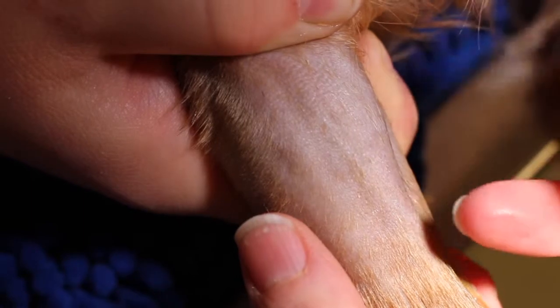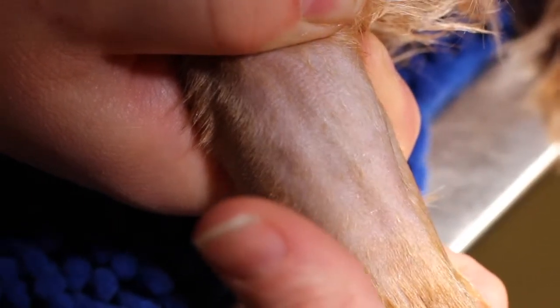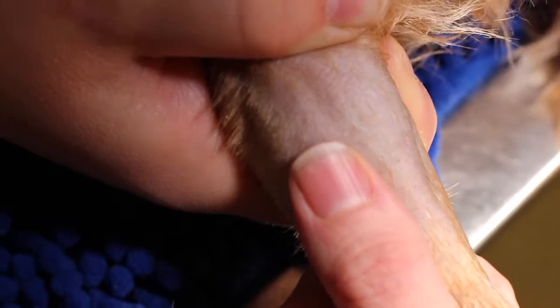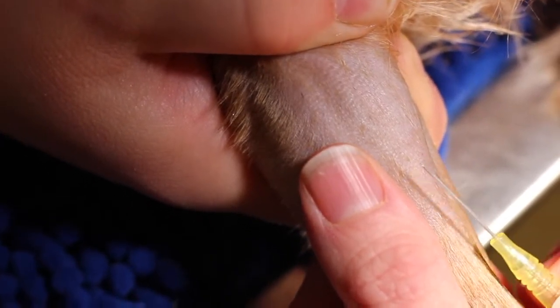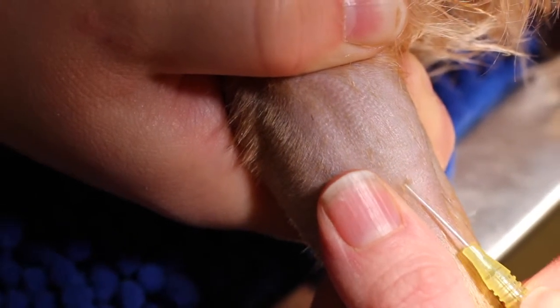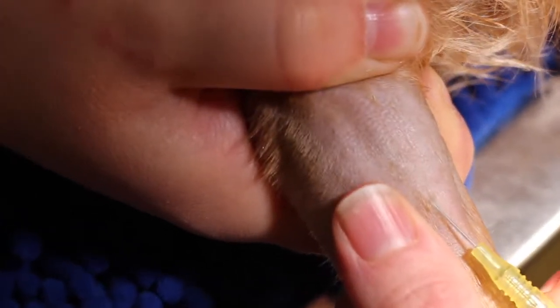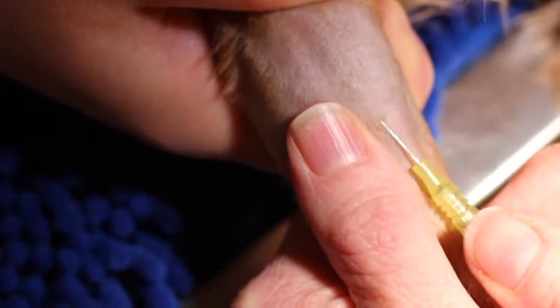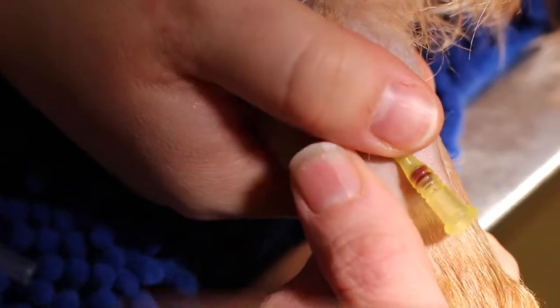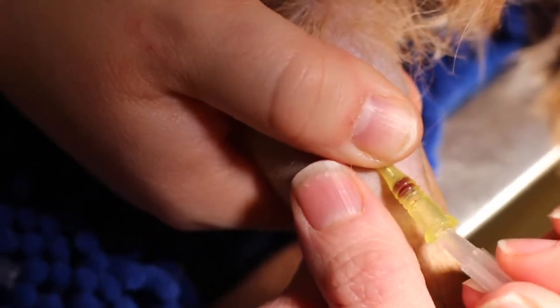I can see my vein running right here — I've already scrubbed. What I'm going to do is put my thumb of my non-dominant hand right against that vein, so that if the vein wants to roll, I trap it between the needle and my thumb. I go in the skin, then into the vein. I get a flash. I'm going to feed just a hair more. Then I'm going to come off. Joy's going to stop that. I'm going to put my temporary cap in.